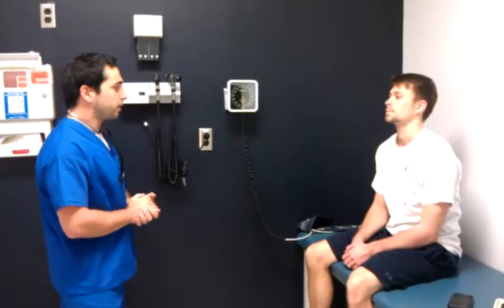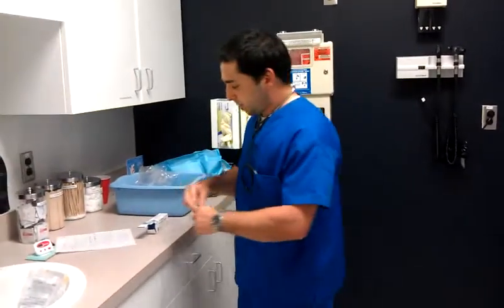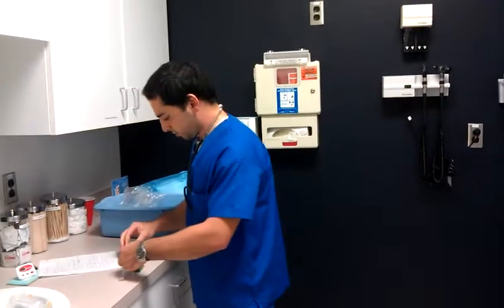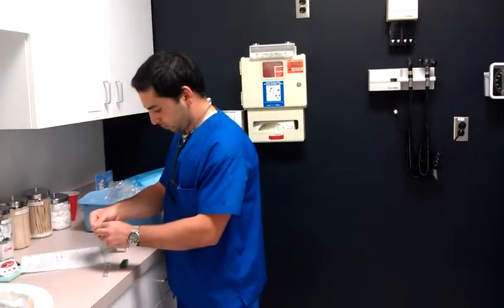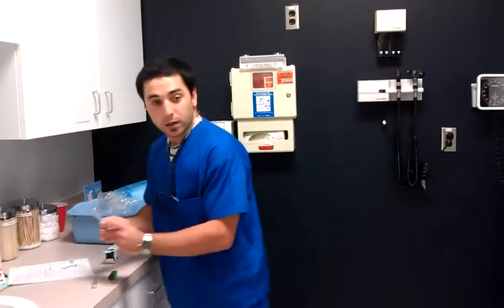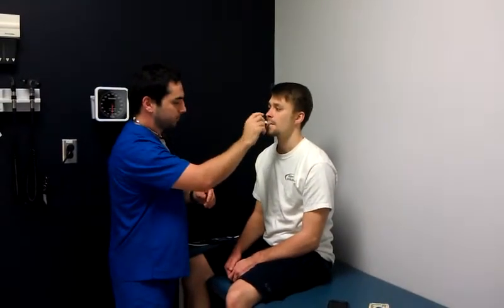4/4/92. Okay, that's great. Well, we're going to go right ahead and assess you for your temperature. I take the thermometer out of its casing and place it in the sheath. It's important to place it sublingually in the patient's oral cavity. Leave it in there for 3 to 5 minutes.